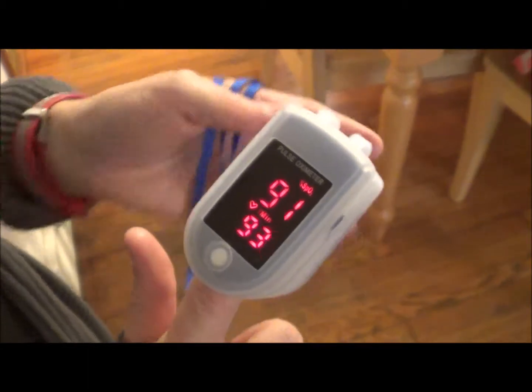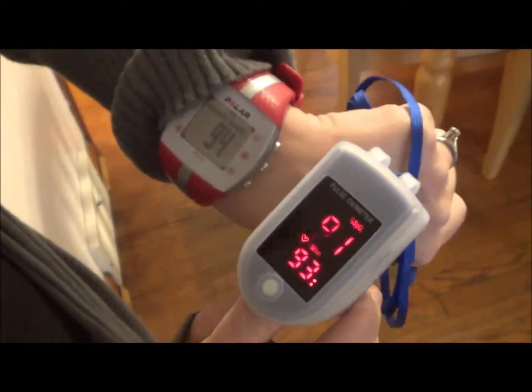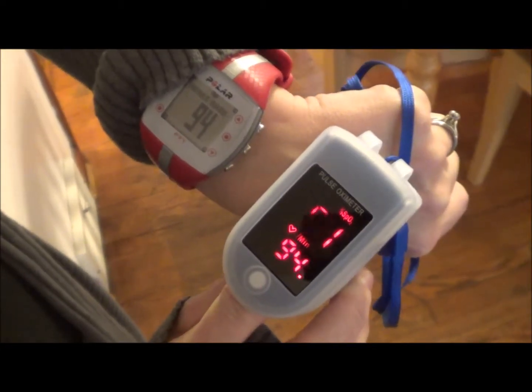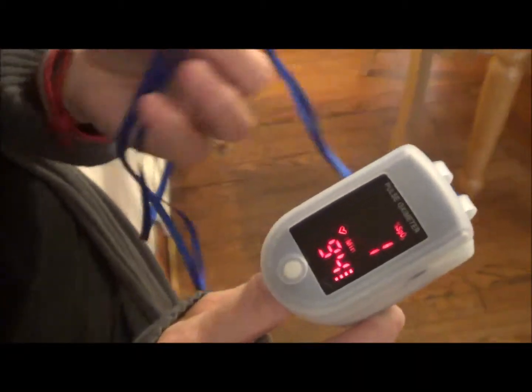I also put on a heart rate monitor on my arm so I could see how accurate it was. You can see that they're pretty much the same right now. They both change as I move around and talk, but they're measuring very close together.